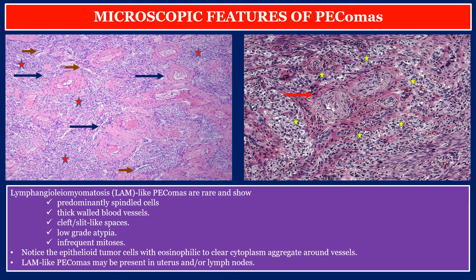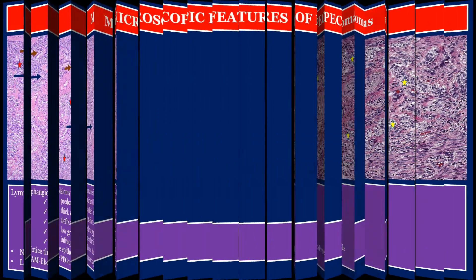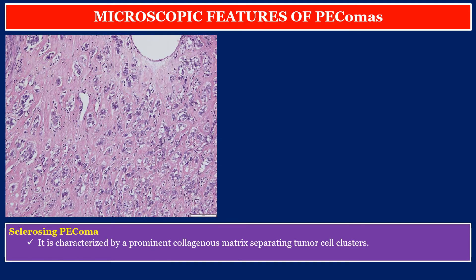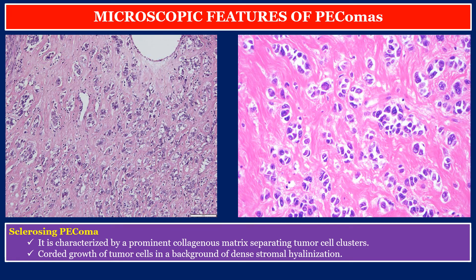LAM-like PEComas may be present in the uterus and/or lymph nodes. Sclerosing PEComa is characterized by a prominent collagenous matrix separating tumor cell clusters. This photo shows corded growth of tumor cells in a background of dense stromal hyalinization.